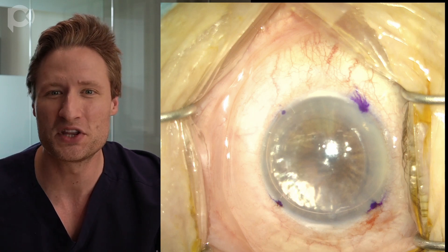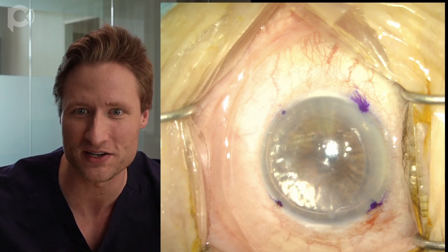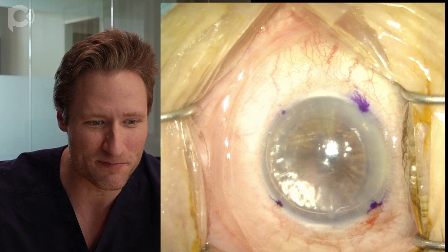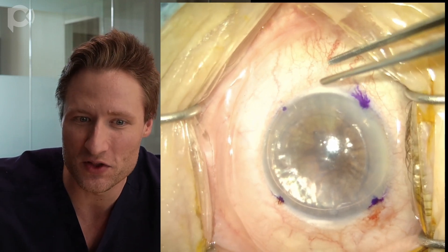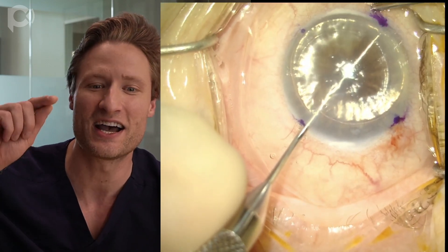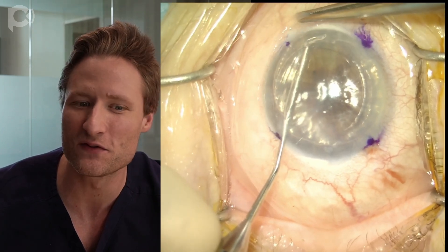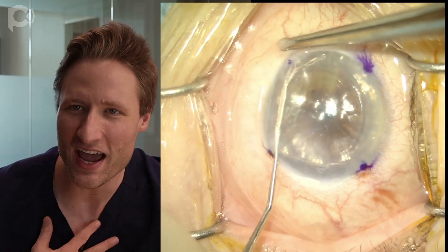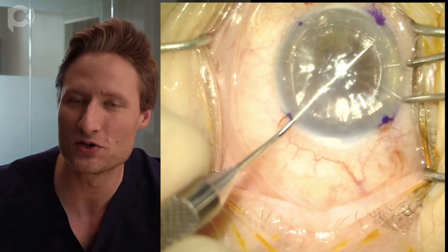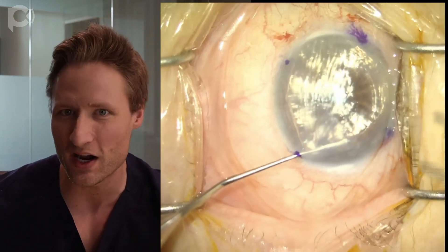You get a full air fill but the eye is not pressurized — it's still a soft eye. It's really useful to have a soft eye because then your descemetorhexis can be done without worrying about air squirting out of a firmly pressurized eye. So now we've got the anterior chamber filled with air and the eye is soft. I'm holding the eye with some utility forceps to stabilize it, and I'm going to start at that little purple mark and strip all around with an inverted Sinskey hook under air. Visibility is better with air than with saline or viscoelastic — you can see the Descemet membrane, where you've scored, and where you've stripped.